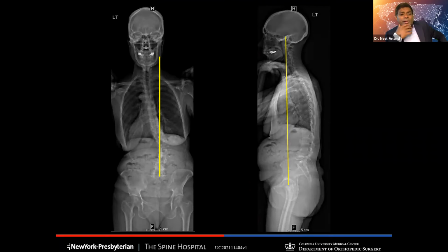What we do, I mean, I still use a staged approach here, multi-level lateral, single position. It's just that we've got very comfortable with it, but I agree, you can do anything you want, but in our hands, a multi-level lateral approach, L5-S1 to L1, 2, and then posteriorly all MIS again, probably T10 to pelvis. And usually we stage it because it helps us evaluate the thoracic component. And I think that's been very, very useful of late.